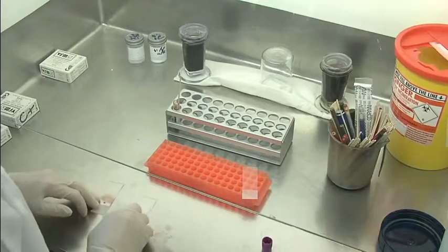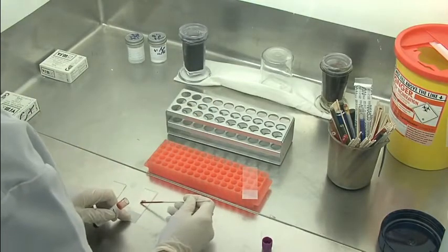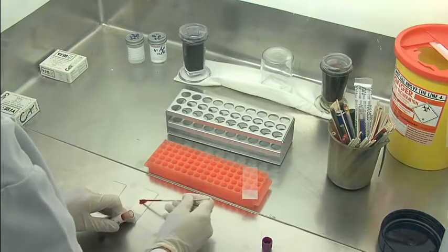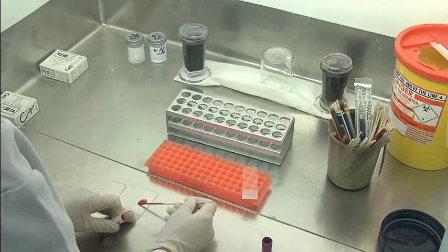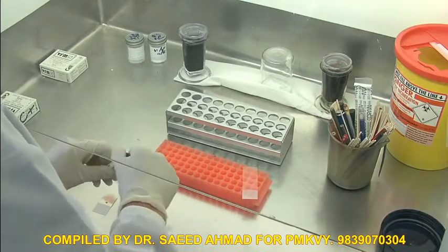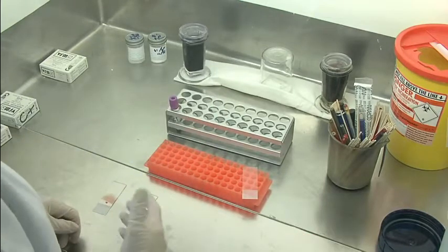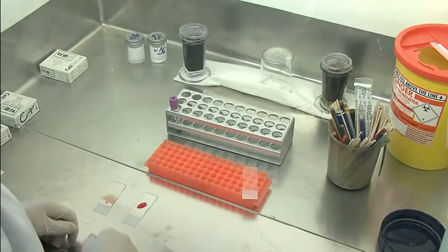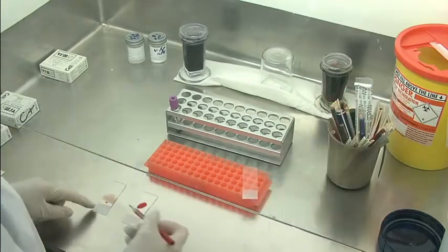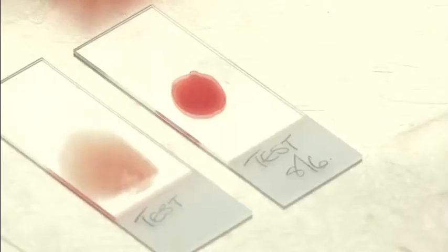We're then also going to make a thick film. This one won't be fixed when we stain it, and for the thick film we use a bit more blood so it's thicker. We're going to lyse the blood when we stain it, so you can look for lower numbers of parasites, and also look for other stages or other species. Remembering of course that every time you make anything, you will always label the films or the slides.